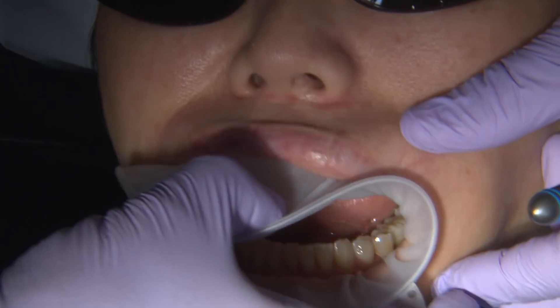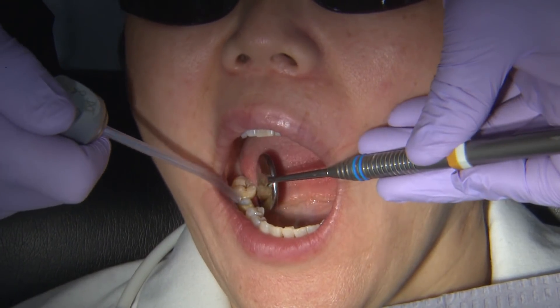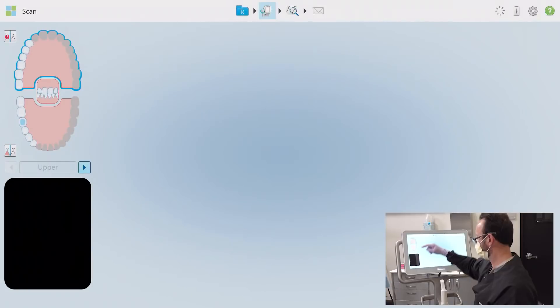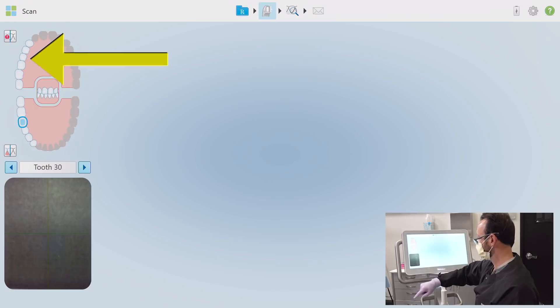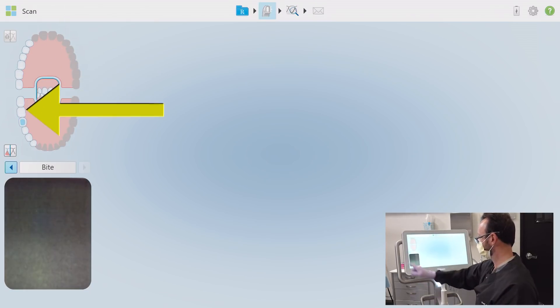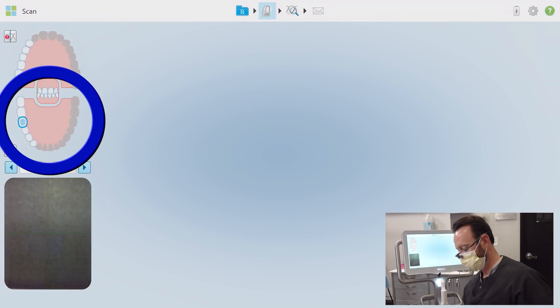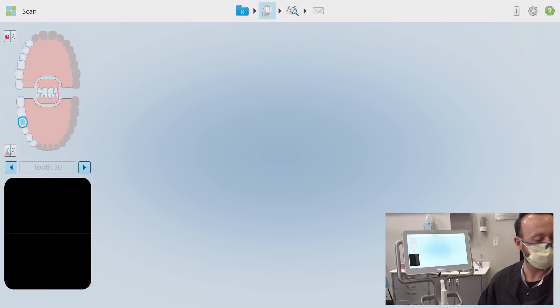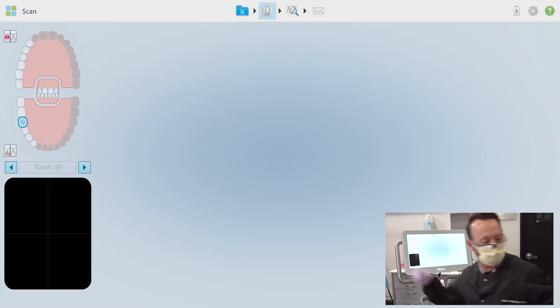At this point I'm taking out the lip and cheek retractor that's already been put in place. This is a personal preference of mine — you may want to experiment with scanning both ways — however I found that minimizing foreign objects in the mouth while scanning increases my comfort level and the outcome is better quality. For these posterior molars only a quadrant scan is required, and the teeth suggested to be included are highlighted in white on the chart model. In cases where the preparation is the most posterior tooth in the arch, it will still be a good idea to capture a full arch scan, just like you would while taking a physical impression, to prevent a simulated bite collapse and poor occlusion on the final crown.